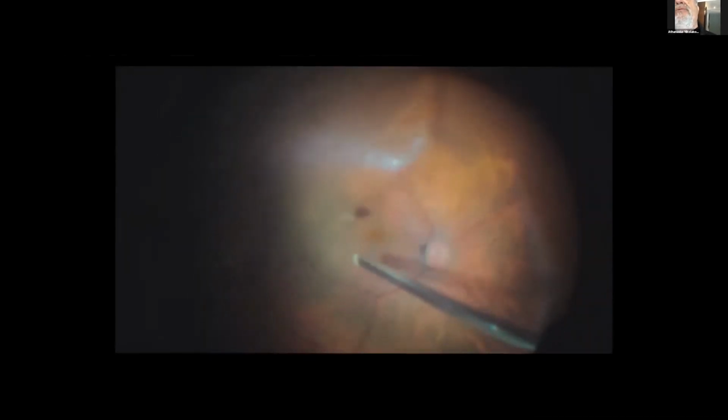That's another trick. When you use endofragmentation, the sucking power is huge and the infusion is less, so sometimes you get a collapsed eye. You have to control it, and you always have to keep the port closed, and you can use the other hand to push the nucleus against the suction of the fragmentation, and you cut it in round shapes. The other point is that all these fragments that go and hit the retina while you're trying to remove it, nothing is happening to the retina. No damage is done to the retina by flying fragments.